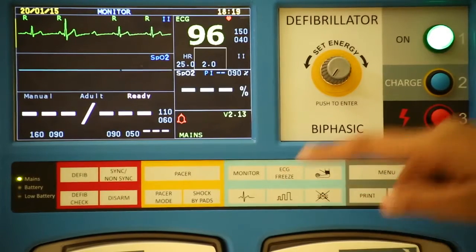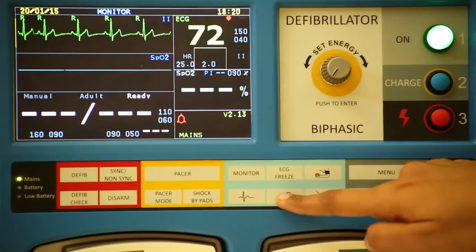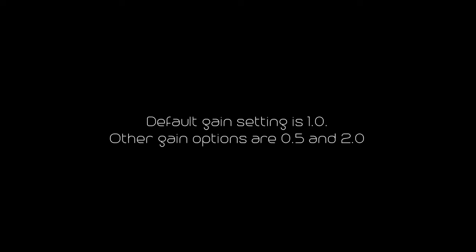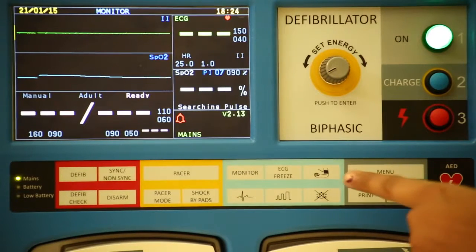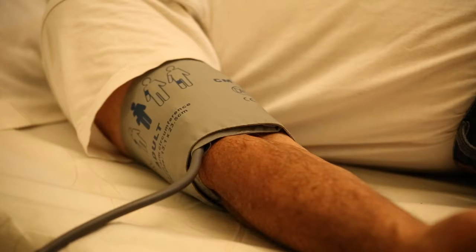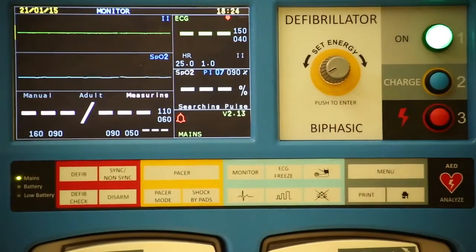Press gain key to adjust the amplitude of the waveform as required. The selected gain is displayed in the upper right-hand corner of the screen. Default gain setting is 1. Other gain options are 0.5 and 2. This BP key is used to check the blood pressure of a patient. Put the BP cuff on the arm of the patient and press the BP button.